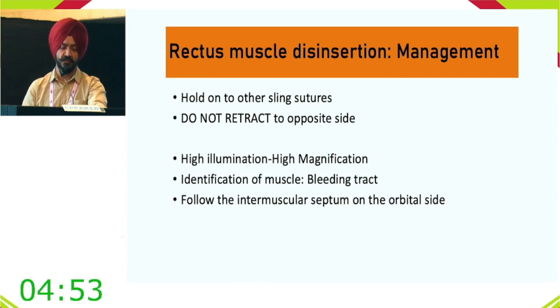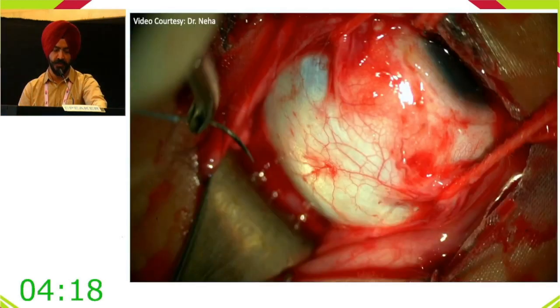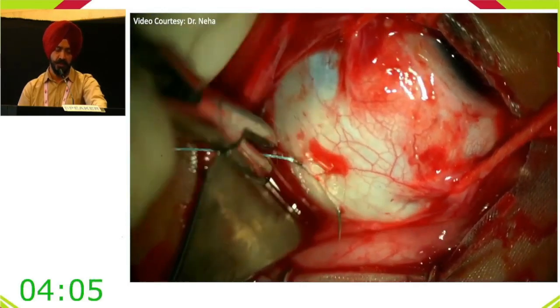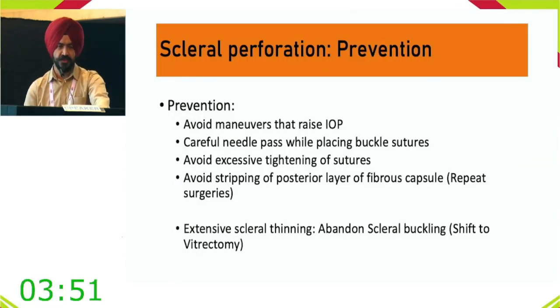For scleral perforation: if extensive scleral thinning is present, it is better to shift technique. In a demonstrated video, the needle is seen passing through the initial scleral track normally, but in the last portion it goes deeper — resulting in fluid drainage from that area. The solution is to remove that suture and place it more posteriorly. Prevention has been discussed; small perforations should be managed by maintaining IOP and examining the drainage site with indirect ophthalmoscopy.